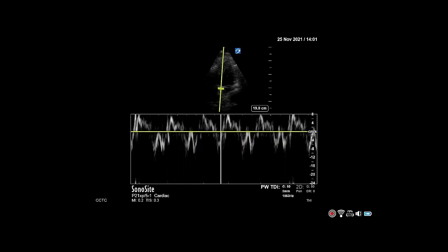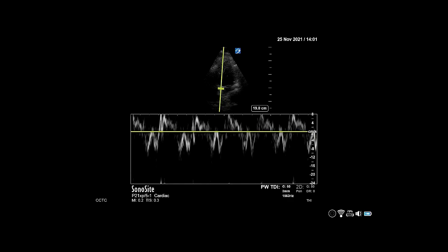Ideally, measure both the lateral and septal E', although sometimes you may only be able to get one.